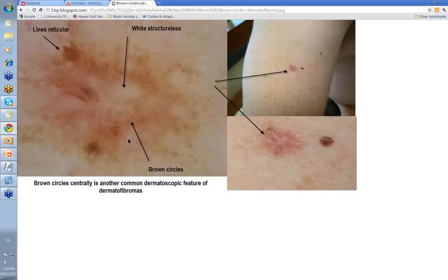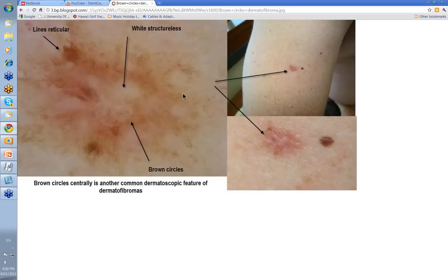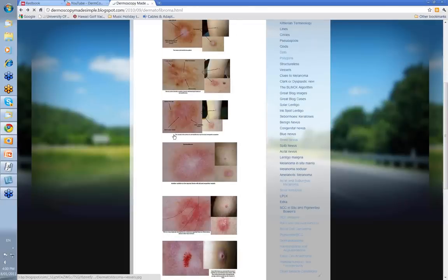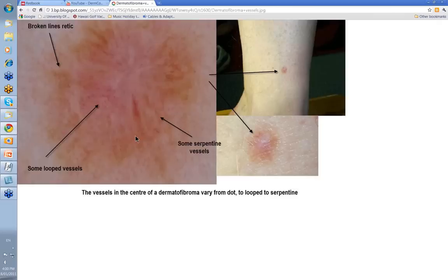Then you can have this one — not quite as organized, not quite as symmetrical. Again, still this white structureless central area, but you also have some brown circles here, and sometimes these can be quite extensive. You've still got your lines reticular round the outside, but it's a bit more broken up. Notice the difference in the nature of the lines reticular in different areas. At a cursory glance you might look at this and think that it's an early melanoma. This is what it looked like clinically — quite pinkish, and at first glance you might think that this was some form of amelanotic melanoma.